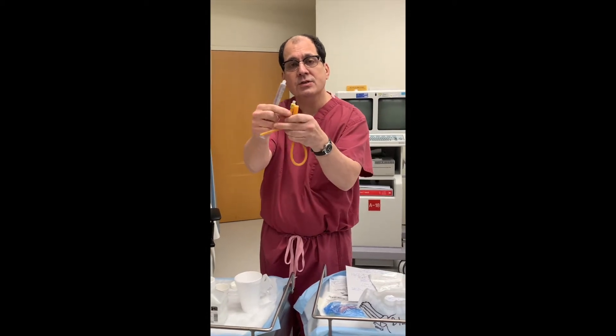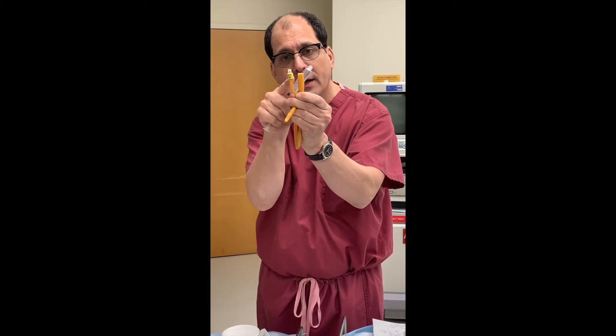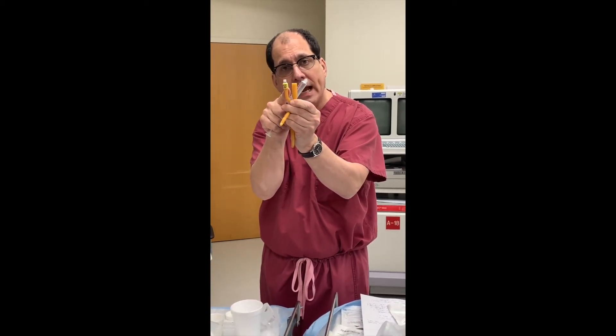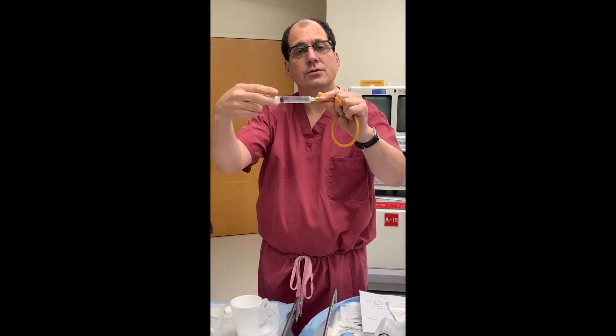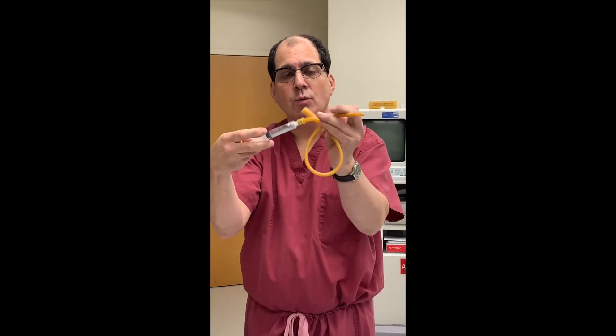You put the fluid into this port. You can see it's a Y-connector: the urine comes out of one side, and this is where you fill the balloon so the catheter doesn't fall out. I'm going to connect this — zoom in if you can — and watch the end of it while I fill the balloon through the port.